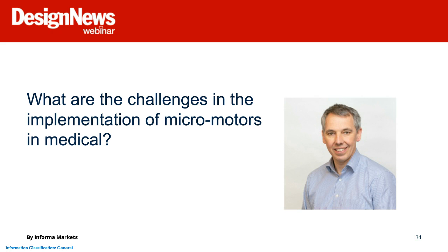If you have something, for example, like an ambulatory device, for example that insulin pump you have shown, that's something you carry around. And then the question is more on the comfort side. And comfort means, can I go swimming with this thing? Does it bother me? So how small it is is more a question of comfort.